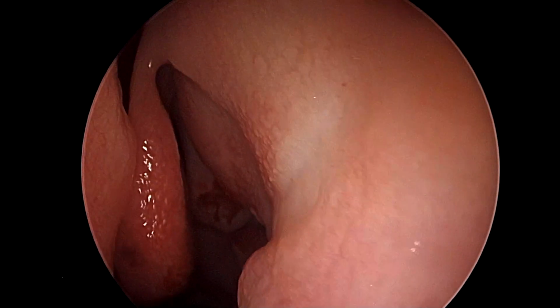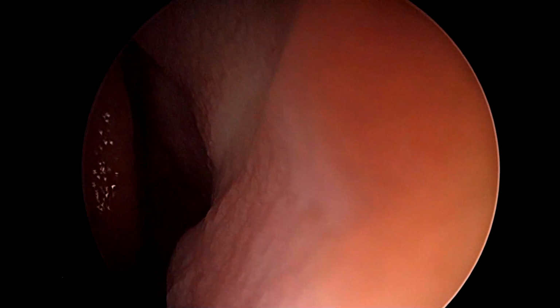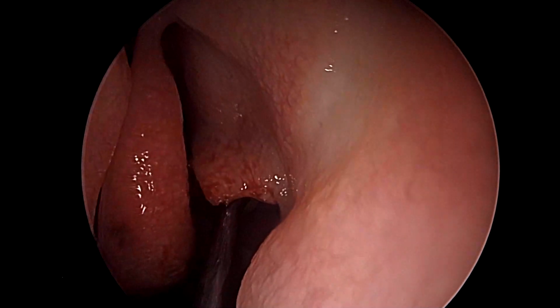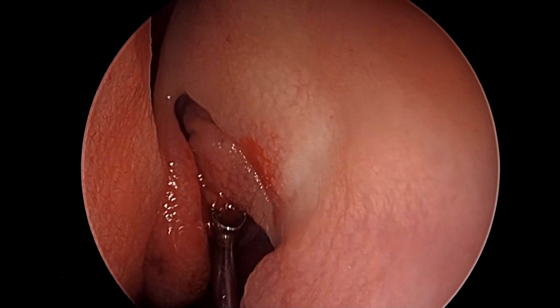We proceed with the left-sided exposure of the fovea via the middle meatus route. Since the defect is in the fovea ethmoidalis and not the cribriform plate, we choose to retain the middle turbinate and do the middle meatal dissection, and we begin by doing an uncinectomy.